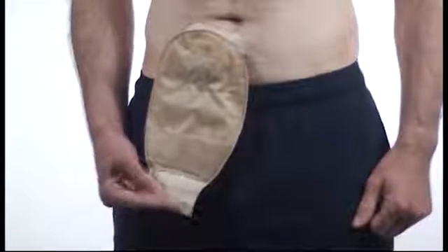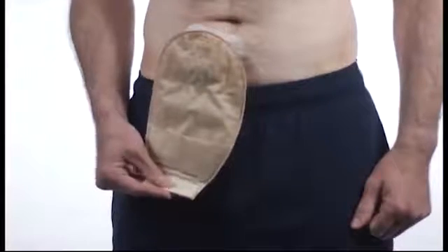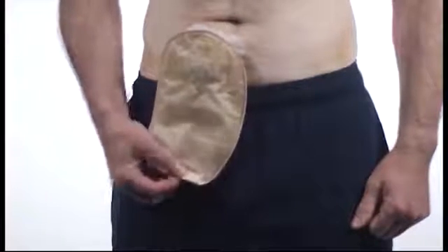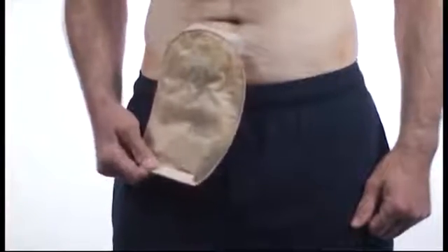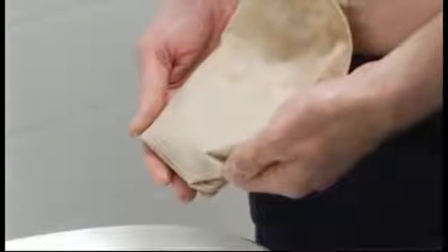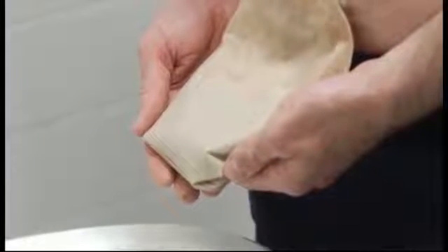To close the InvisiClose tail closure, roll the tail up 3 times and lock by pressing the closure strips together. For added protection and comfort, you may also fold the tail into the locket pocket, as shown. Remember to empty the pouch when it is 1/3 full.